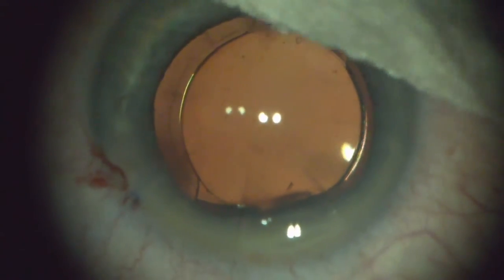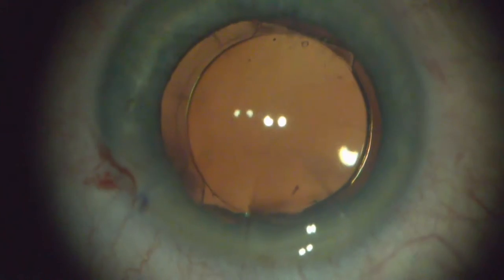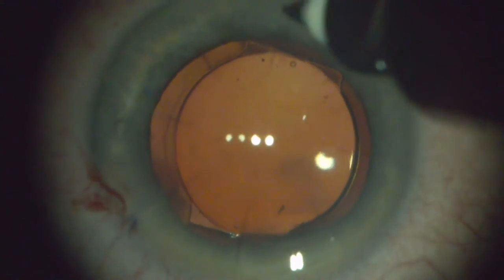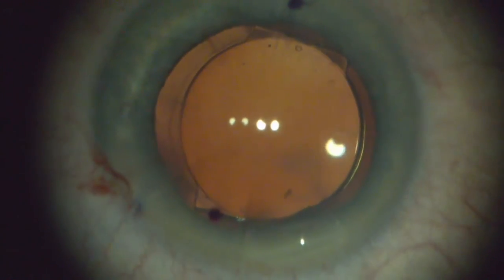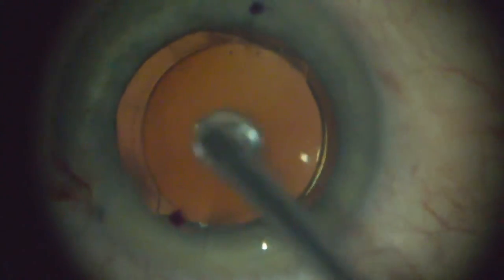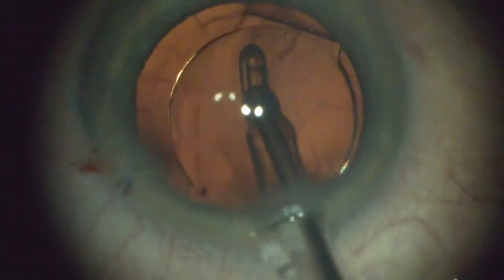Once this is aligned — and I use Aura — once this is aligned on your steep axis, before I take the viscoelastic out, I mark the external cornea. I don't have to redo measurements, so I can see grossly if this lens moves in the eye. It's a nice little pearl that I use on every case, so I can take the viscoelastic out knowing that that lens is not going to move away from those dots.